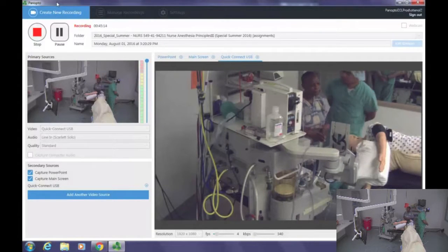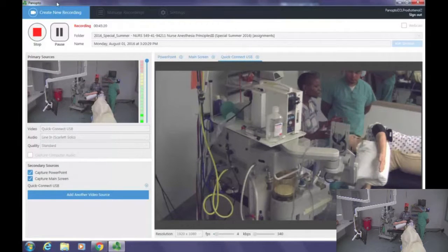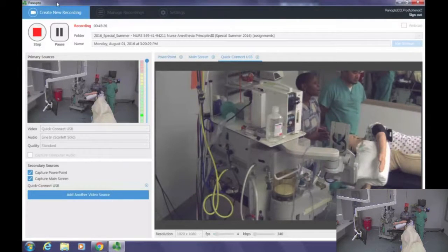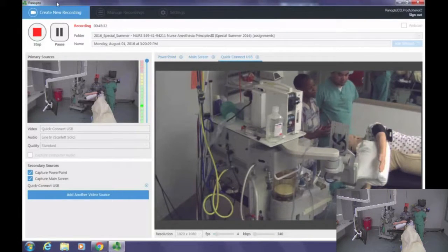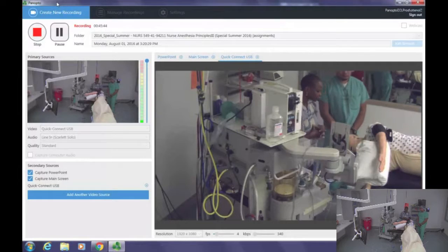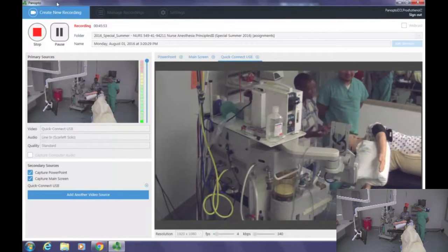And then for emergence, when the surgeon is approaching closure, we're going to reinflate the surgical lung gradually to attain a pressure of 20 to 30 centimeters of water. This is to prevent damage to the surgical lung, and also to allow the atelectatic lung to get recruited.